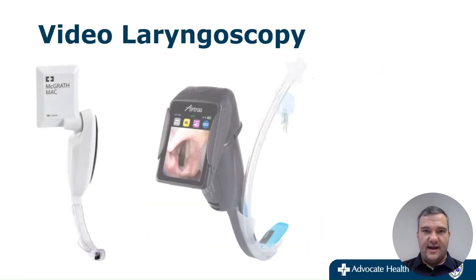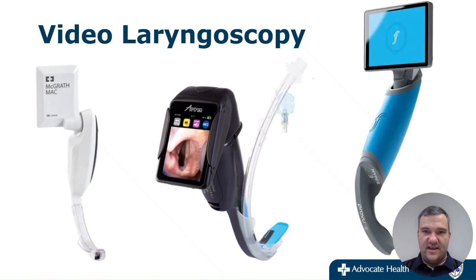Video, that is what most of us are using now. There's a variety of different ones. So far within our system, we have not mandated any specific video device to use. Whatever your system has is appropriate, as long as you are all comfortable using it.